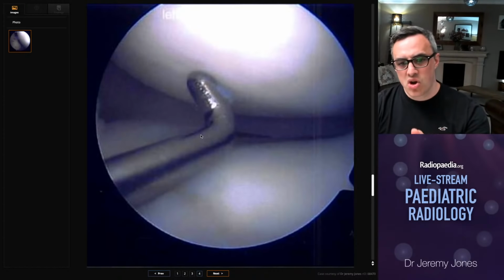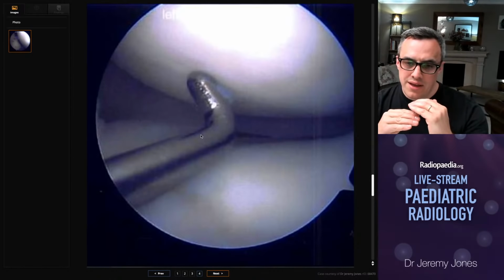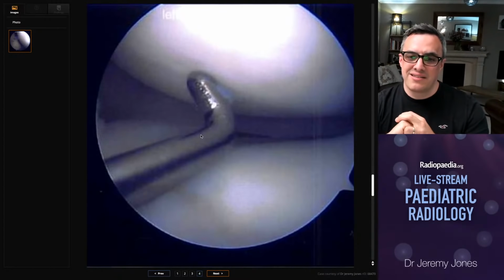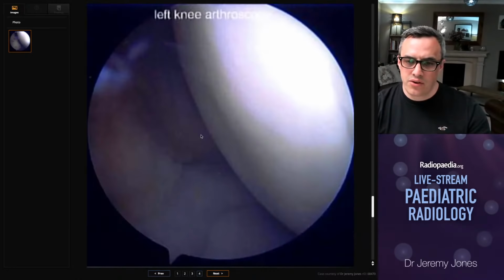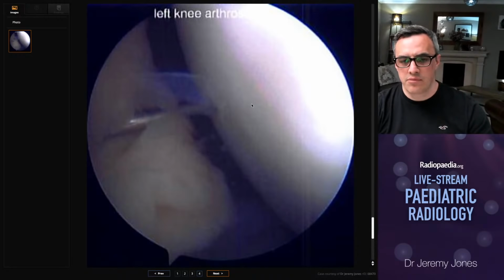But as the surgeon pushes, he's feeling that actually the soft bone, those scrambled eggs sitting underneath the cartilage, are deforming and being pushed away. And so then went on to micro drill up through the lesion about 10-15 times. And that's a 1 millimeter heavily zoomed up K-wire essentially being used as a drill to drill the lesion.